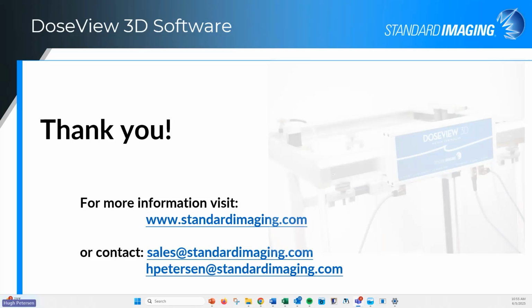Yeah, so the nice thing about it is it's an aluminum platform that the water tank itself sits on. It locks into place on that, and then you can actually rotate the tank to your 45. So if you're doing a 45-degree diagonal, there are detents in the platform that lock it into place. You rotate it, and you can feel it click into place at 45. It makes your diagonal scans very convenient.